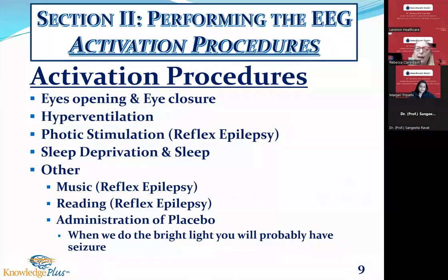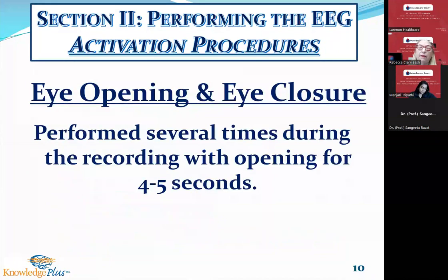So back to activation procedures: listen to the environment in which your patient has their events and try to recreate that environment. Now, with something like musicogenic epilepsy or reading epilepsy, that requires the approval order from the neurologist or referring physician, if it happens to be psychiatry where you're from. So anyway, try to recreate, activate the environment of the patient's episode.